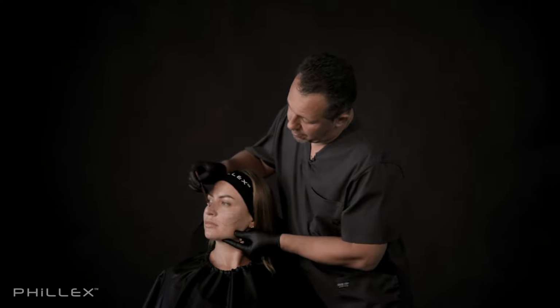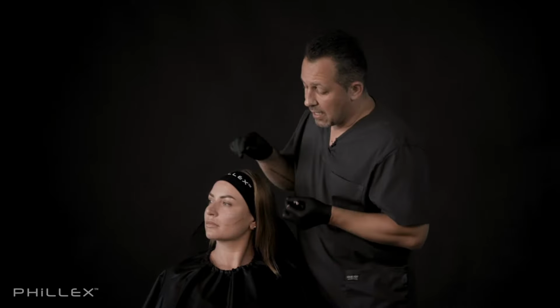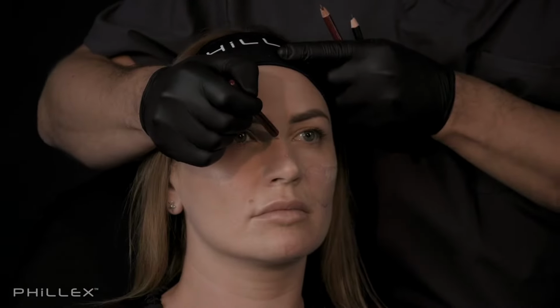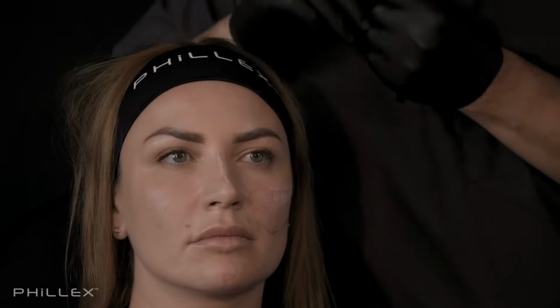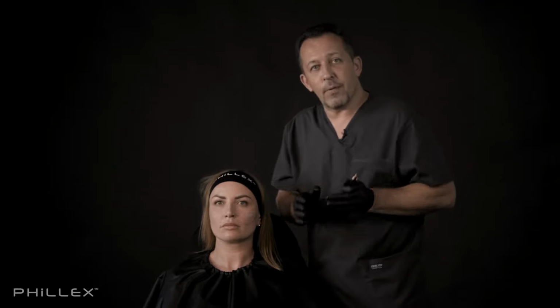deficit of the volume here and here, so we will replace it, and when we replace it, her nose will be better. But even more, we will put some light volume in the middle part of the nose, so we will create like a small line. And due to the concept of light and shadows, if we put some very thin volume here, we will make the nose thinner, and it will be more harmonious to the whole face.